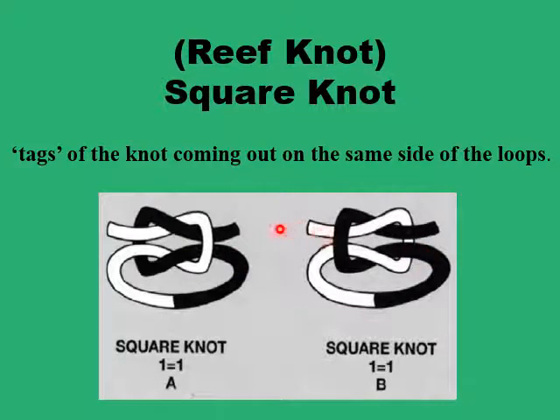And it's secure because any tension on this end of the suture line is going to increase the interlocking. Whether the tension is applied on this side of the suture or the other, you will be pulling the same end through the closed loop of the other end, and this adds to the security of the knot. This is the basic surgical knot, the square knot.